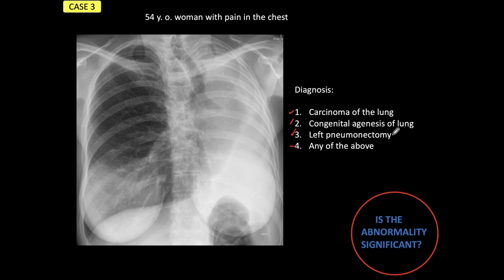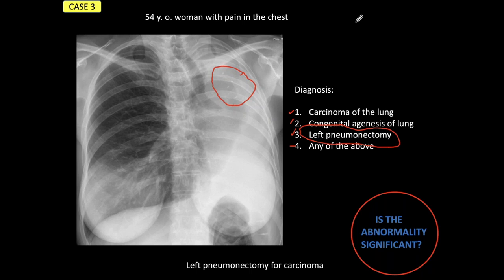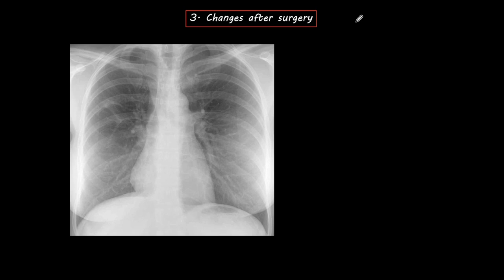Back to the presentation. What we see is the hallmark appearance common to carcinoma, congenital agenesis of the lung, and left pneumonectomy — all of them look the same. But there is a difference here: we see metallic sutures. When we see metallic sutures, we can be sure the patient has been operated on. So our correct diagnosis should be left pneumonectomy. And when we look at the clinical history, the patient was indeed operated on for carcinoma of the lung. I'm showing this case to emphasize the importance of metallic sutures in the chest — this is the third chapter: changes after surgery.